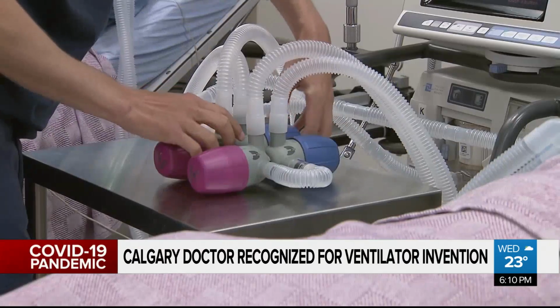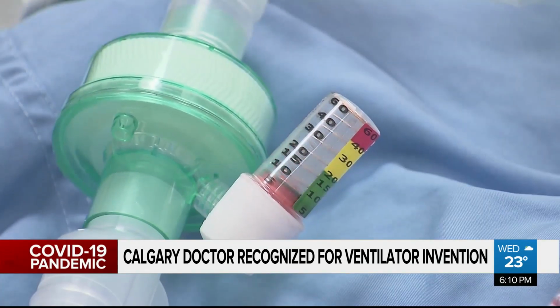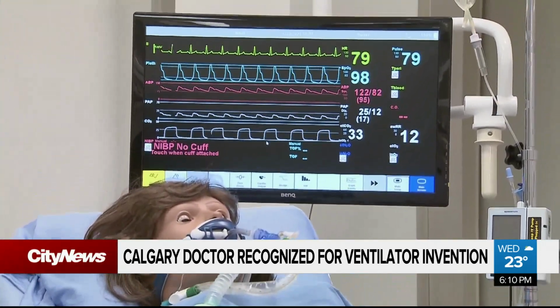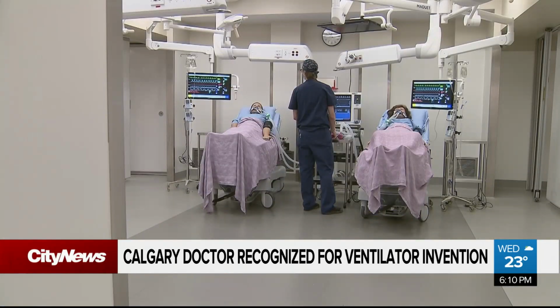At the beginning of the pandemic, there were ventilator shortages and foreseen ventilator shortages, and people were discussing splitting a ventilator. Traditionally, there are 2 big barriers when it comes to people sharing ventilators, each individual needing their own breath pressure and making sure individuals aren't sharing air. I discovered a solution that actually seemed like it could safely split a ventilator and do the job that needed to be done.